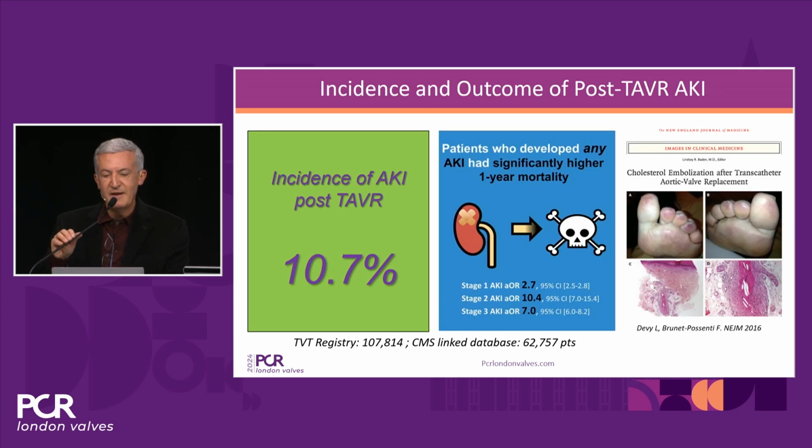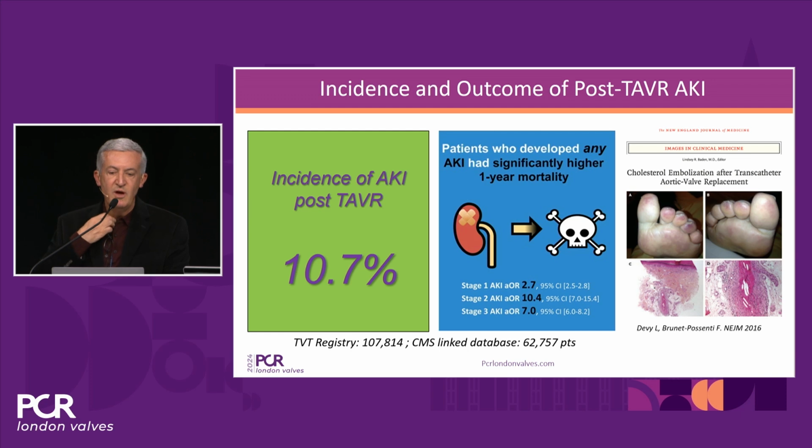So this is, again, my final slide, just highlighting the potential benefits of having a filter that not only will protect the three vessels that go to the brain, but also the full body, to perhaps prevent more injury to the kidneys, but also peripheral embolic phenomena.